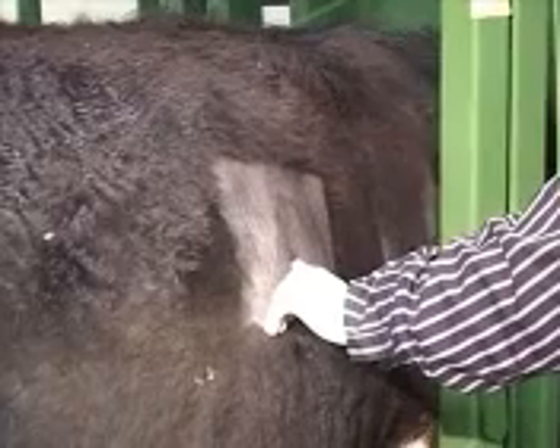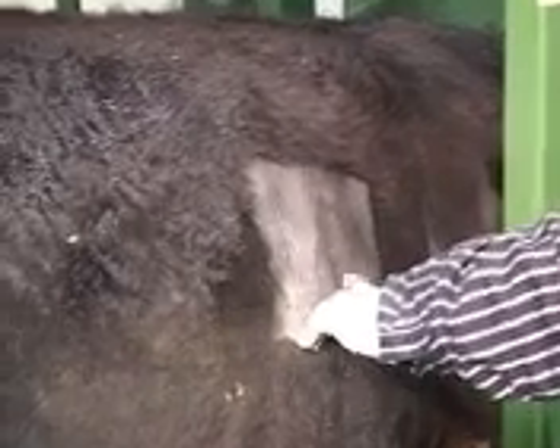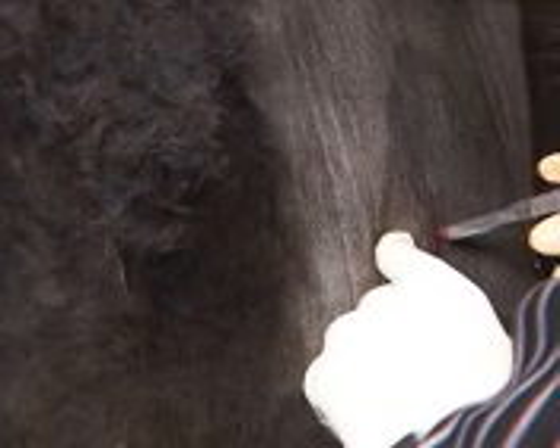Right here, because you've got the point that you stuck the needle in, you'll have just a trickle of blood there. When you get ready to go in, just a straight punch through the skin — that's all it takes. That leaves you a very, very small hole in the skin that you don't have to close. There's no suturing, nothing that you have to do at that point.